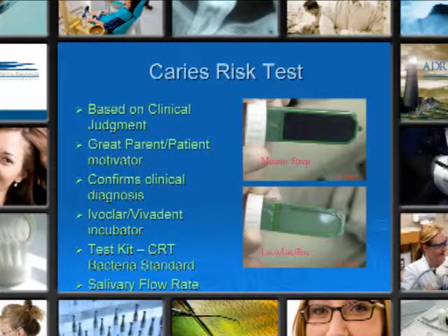This is what a caries risk test looks like. We use them now based on the clinical judgment as you as a provider. It's a great parent-patient motivator. It confirms your clinical diagnosis graphically and something that the parents can see or the patient can see that they actually have these bacterial problems.